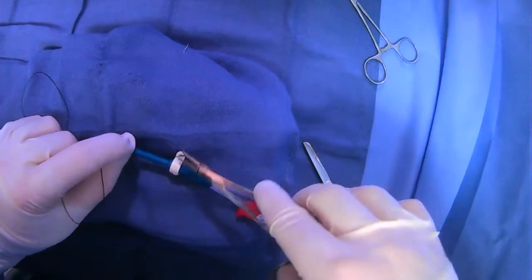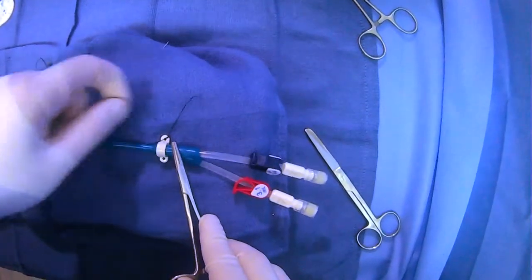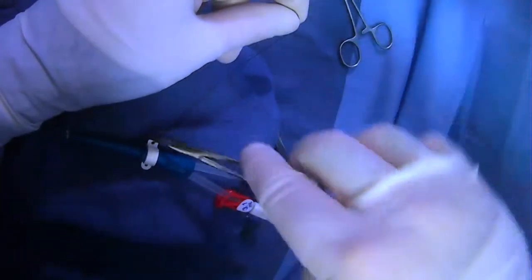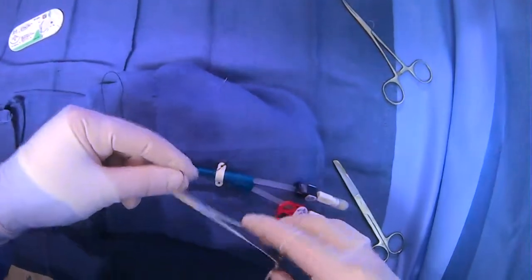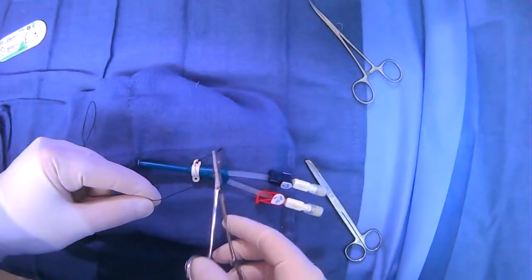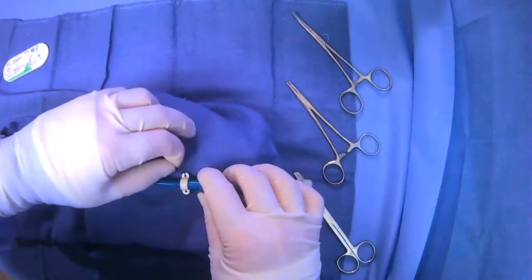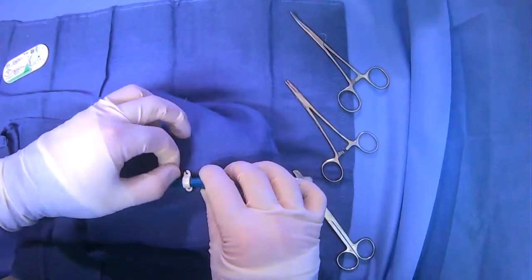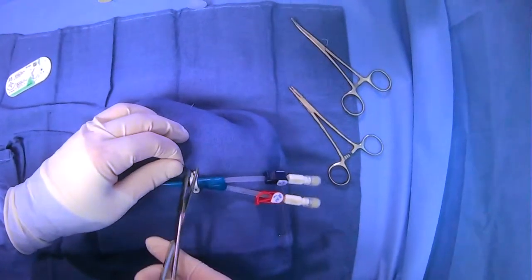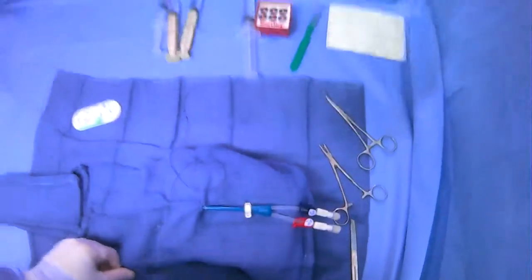We have to be careful — it is maybe a little more advantageous to have a longer tail when you're working here. There we go. We can expose our tail and do the rest of our instrument ties. And now we can just cut.